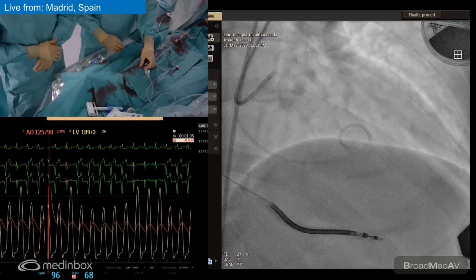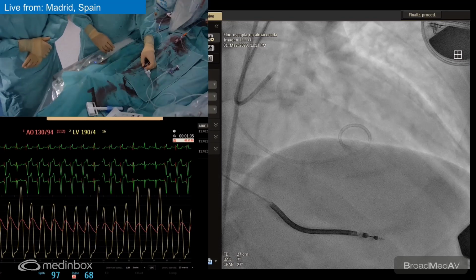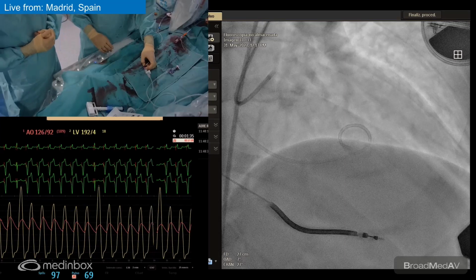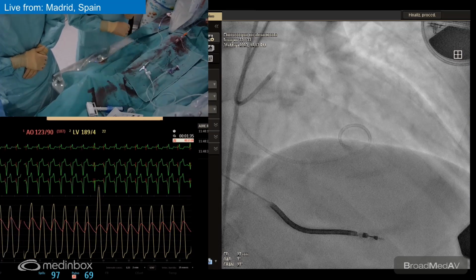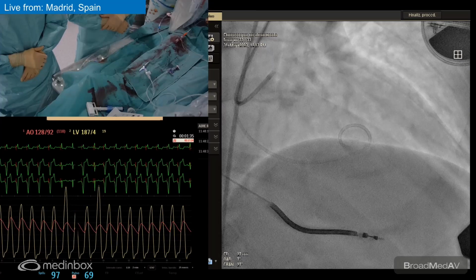Okay. And we are going to see if the septal is okay with some, what's the name? Echo marker. Yeah, we are using gelafunin, and you can see the hands of Patrick working with the gelafunin.